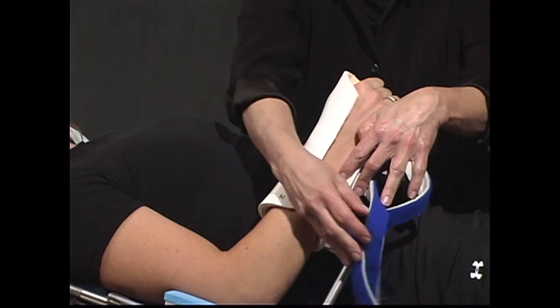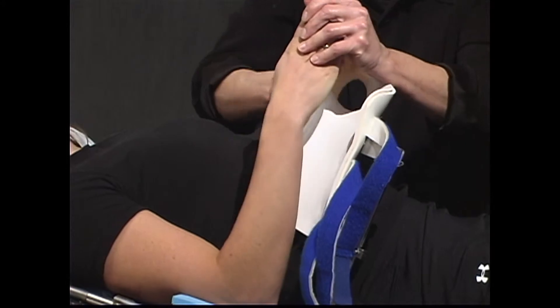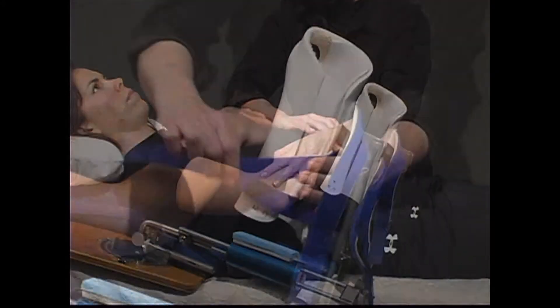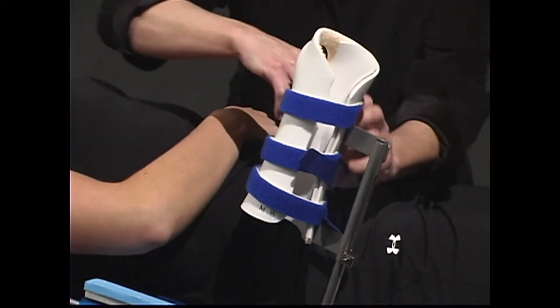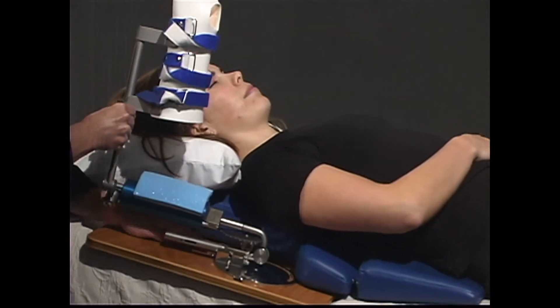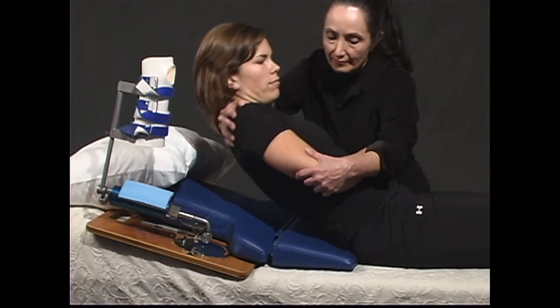To remove the patient, open the three blue velcro straps on the hand piece. Gently remove the patient's forearm and hand and rest the patient's hand on their body. Re-fasten the hand piece again. Press the button on the metal dial of the wooden board to release the mechanical arm and bring it up to a vertical position, then help the patient up.